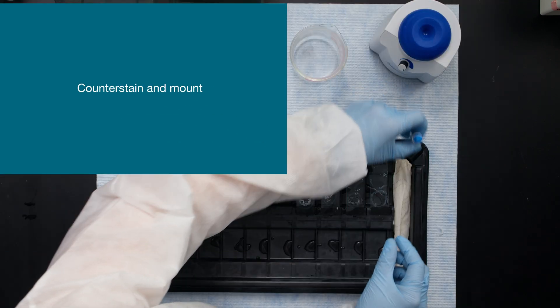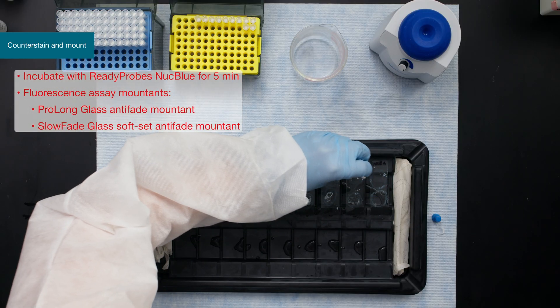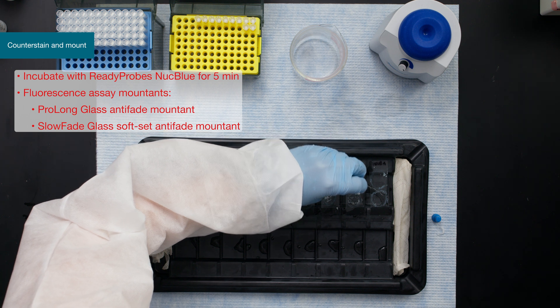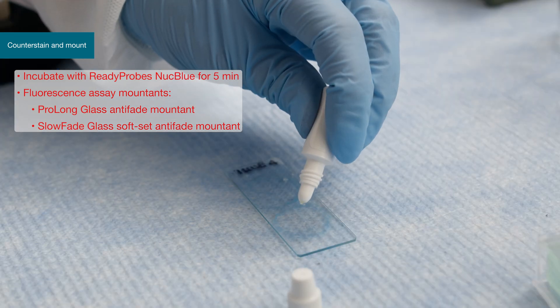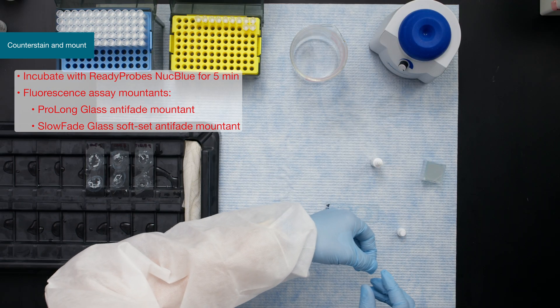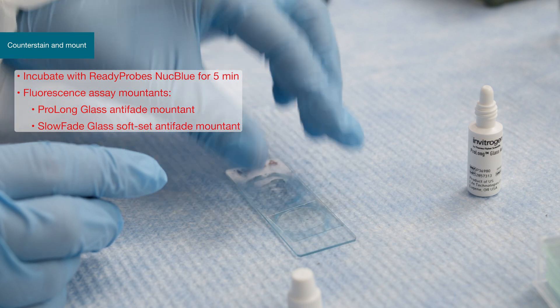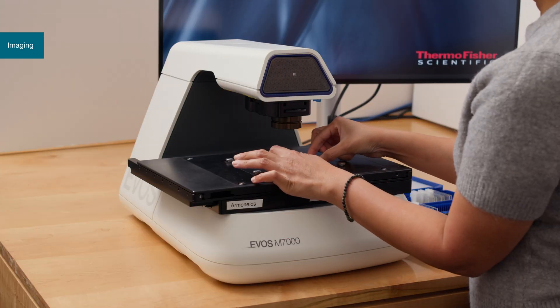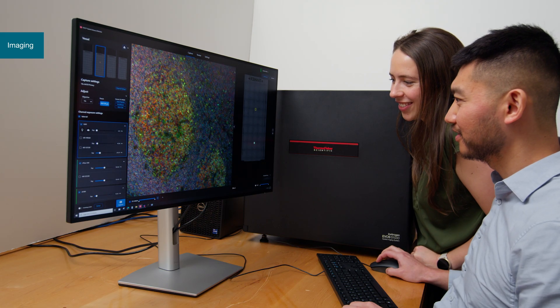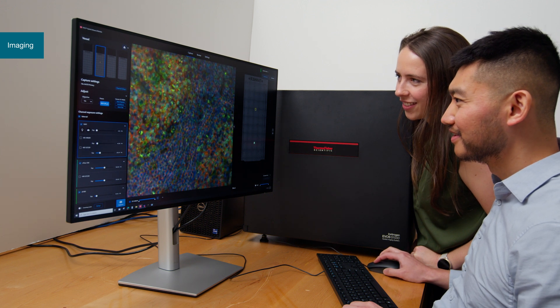Before imaging, perform a nuclear counter stain following standard protocols and proceed to mounting. For this assay, mountants containing anti-fades are highly recommended. Add mountant and carefully place the cover slip over the tissue section. Keep slides protected from light. Finally, your samples are ready to image using a fluorescent microscope. Using the EVOS imaging system, beautiful images can be captured.